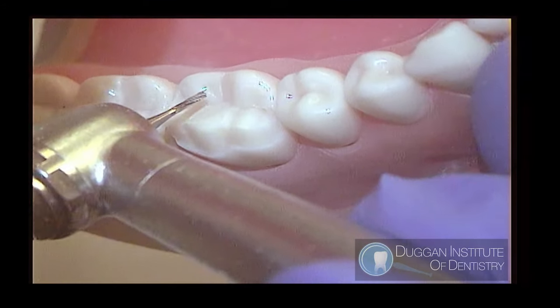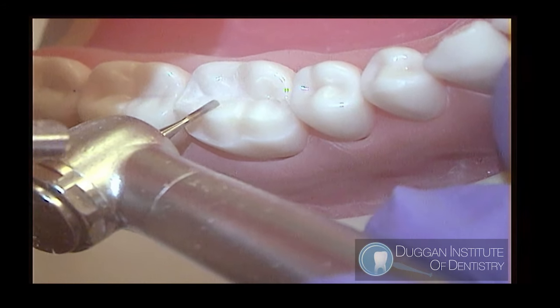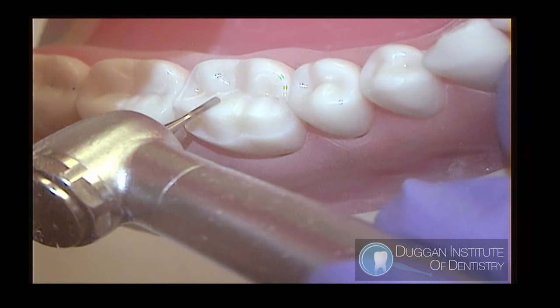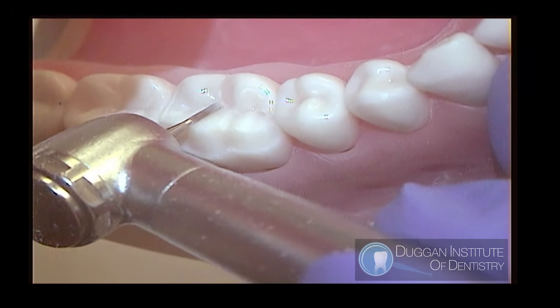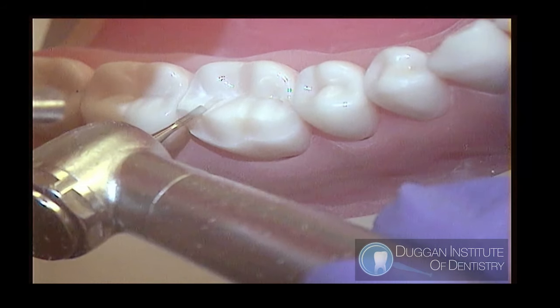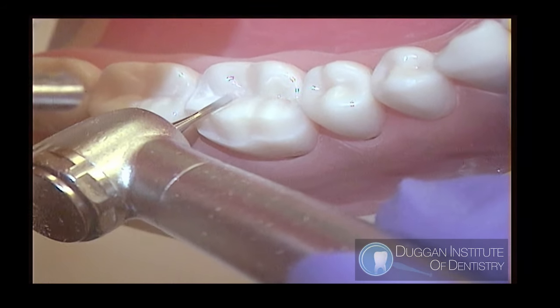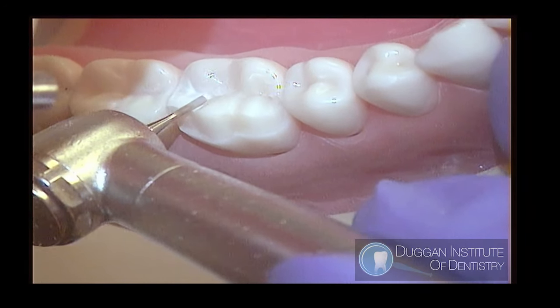Now we can reduce the distal buccal cusp. Take the angle from the matching adjacent cusp, position the burr from the distal and slightly tangent to the adjacent tooth. Keep the burr parallel to the ridge, point the burr and follow the central groove. Reduce half of the cusp at a time.